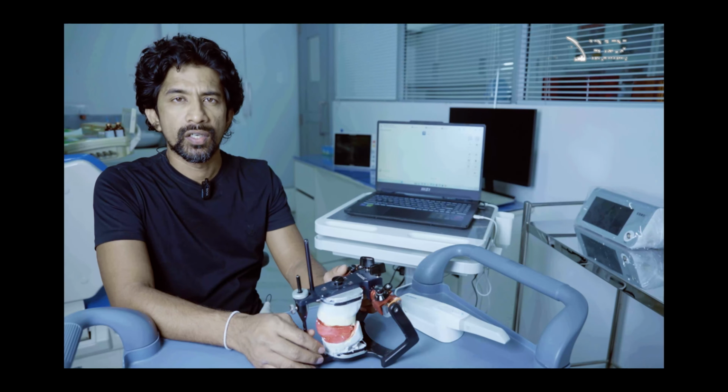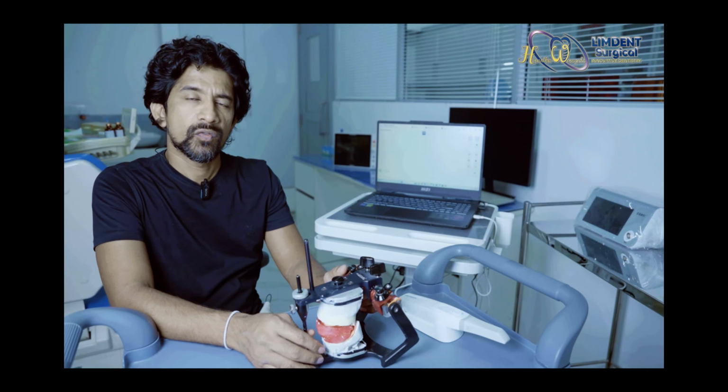From that step we can get into the permanent prosthesis design and communicate with the laboratory technicians to mill the final prosthesis according to the features the clinician needs.